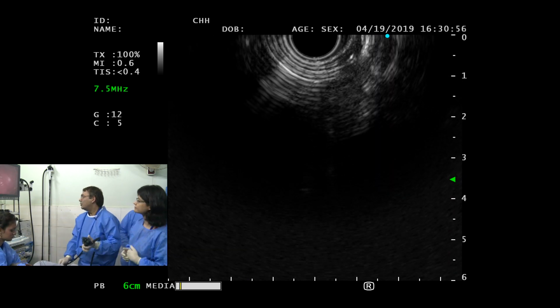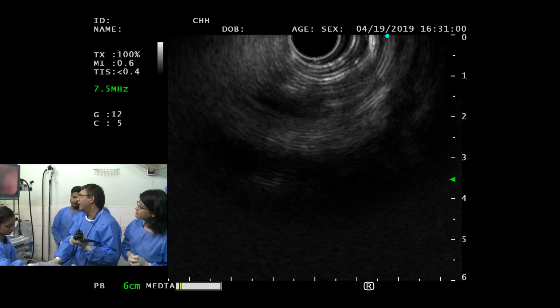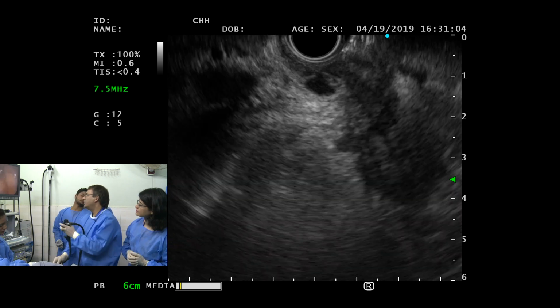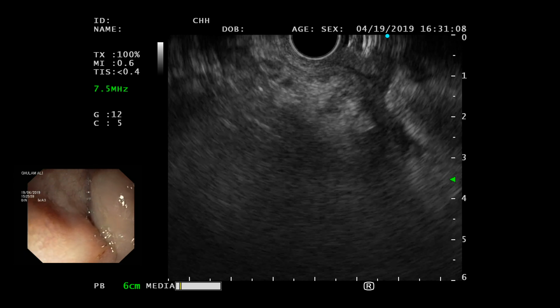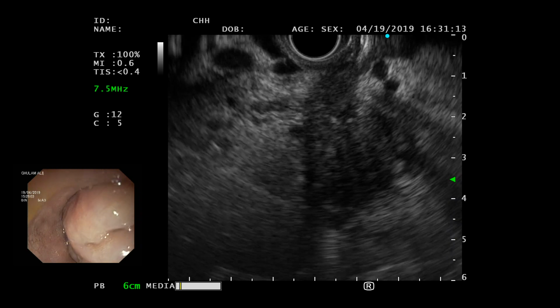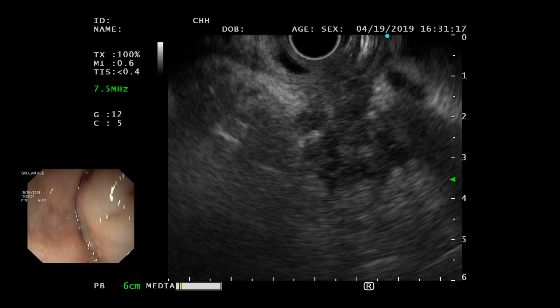Khalid, can you tell what the difficulty is here? I'll tell you in a moment. First, I couldn't tell what the difficulty is. This was the difficulty. So there is a little bit of compression there, and I think it's all because of the pancreatitis. You see that? Yes, we can see that. Yeah. So it's all because of the pancreatitis.